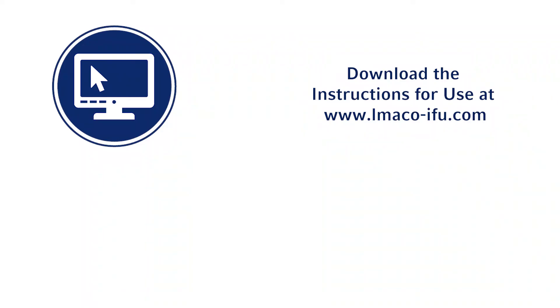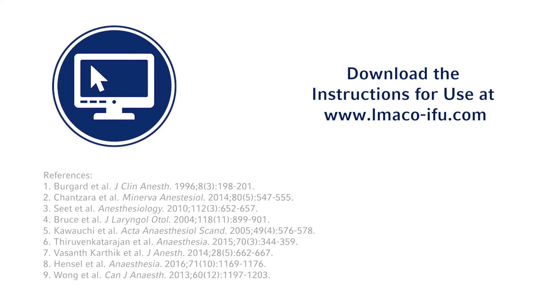This completes a demonstration of how to use LMA Airways with Cuff Pilot Technology. For more information and to download the complete product instructions for use, visit lmaco-ifu.com.